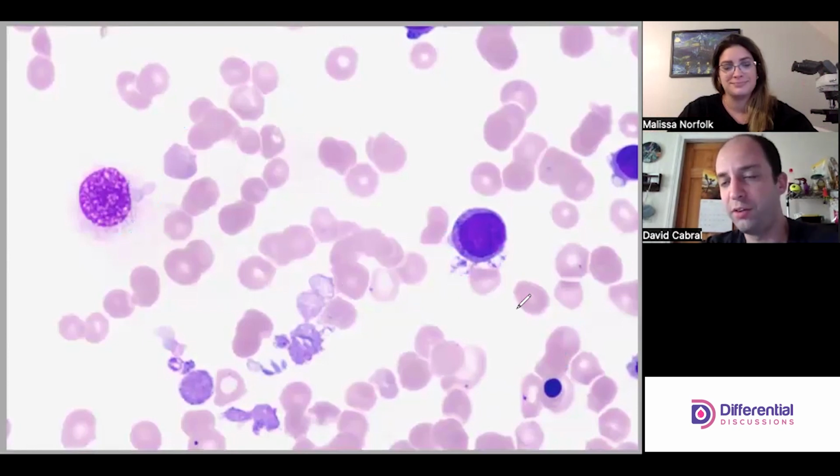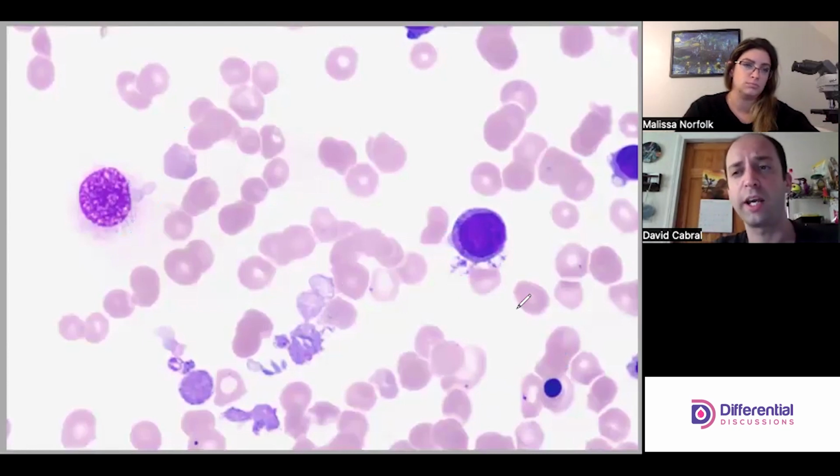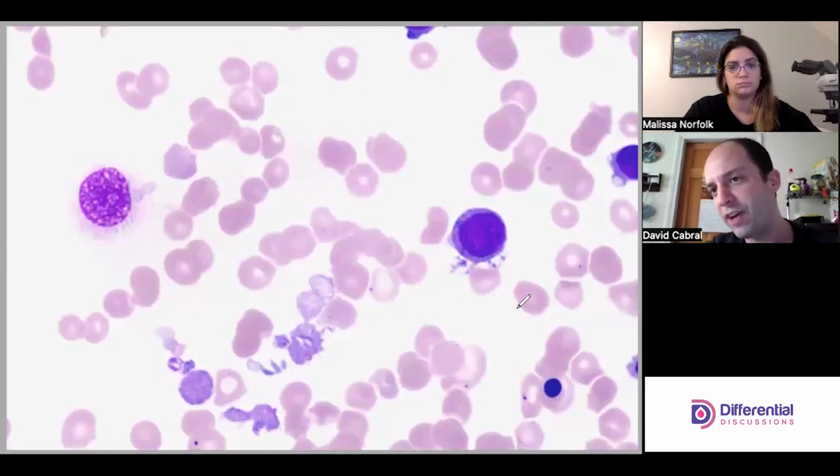I think a lot of you might go through your whole career and not see something like this. It's entirely possible. But I want to spend a little bit of time on the dark staining nucleus. We're going to see some, I'm pretty confident, because I don't think it's rare. I think it's pretty common where we have a nucleus that's really, really dark staining. What I've seen a lot is techs questioning the stain. Something's wrong with the stain, right? They'll stain a second slide, which I won't fault you for, trying one more time. If you get a second slide that's producing the same effect, stop.